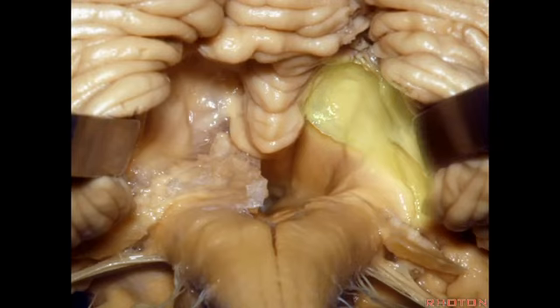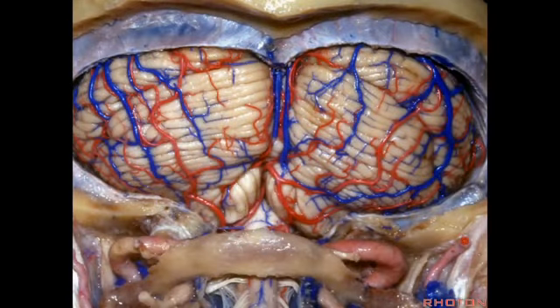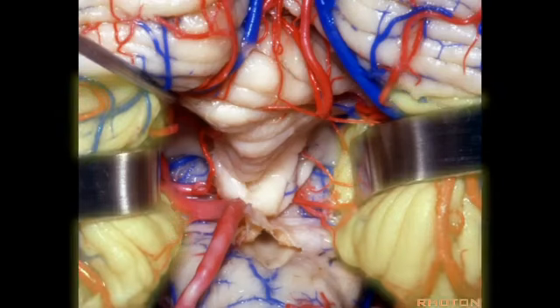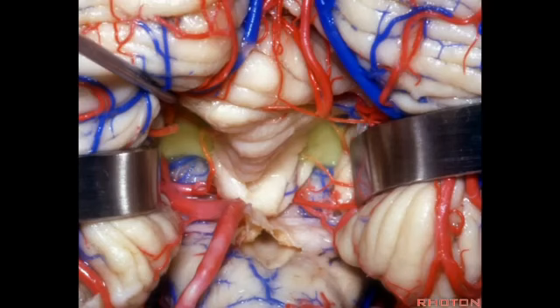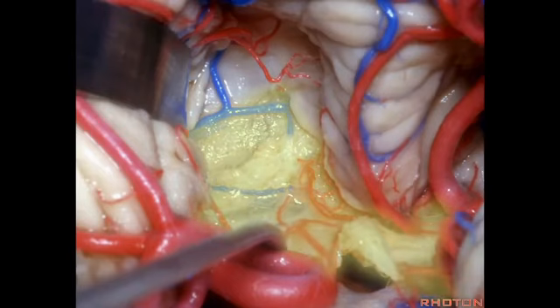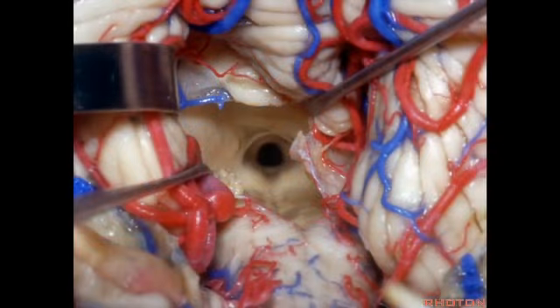Here's the paper-thin velum that sweeps lateral to attach to the flocculus, so that if we have a lesion in the fourth, we don't split the vermis. We go here adjacent to uvula, you retract the tonsils, and you see the tela and the velum. And you can get in off to one side of the uvula. Here we see tela and velum. And you open the tela, you have a view all the way up to the aqueduct.